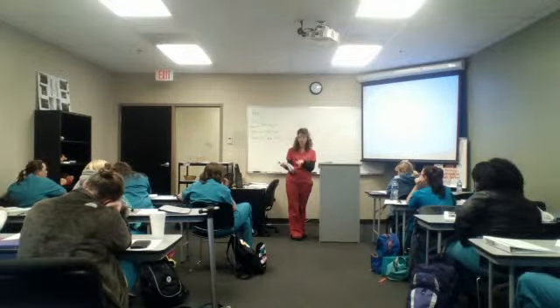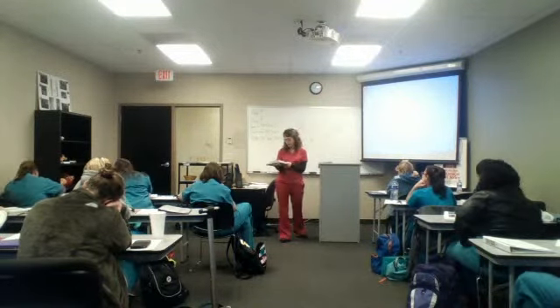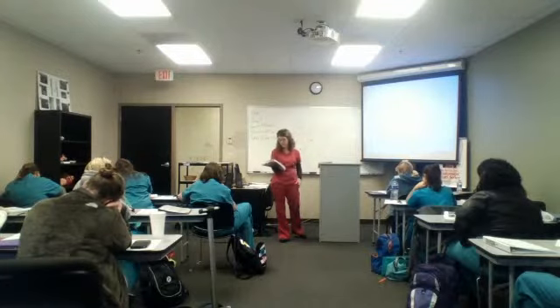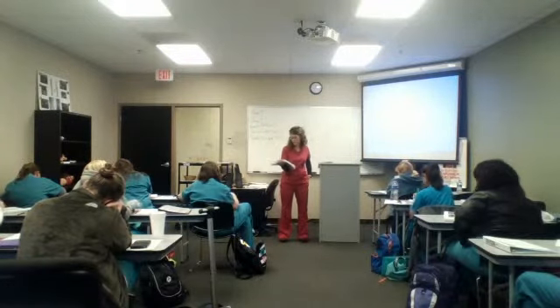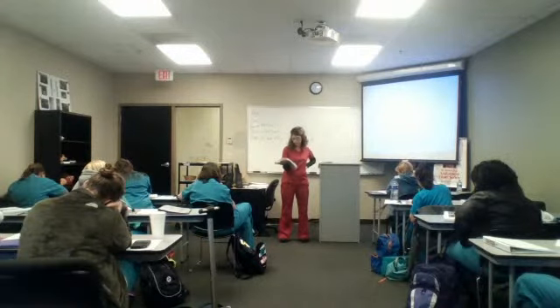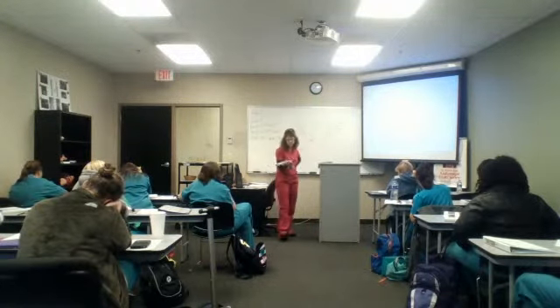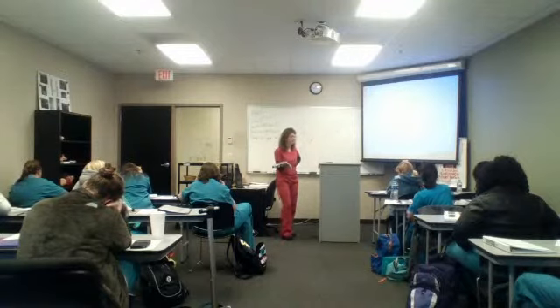But if a patient comes in hurting in their calf, it's very important for us to scan these veins because they're the most common site for thrombus to start. And so that's what it said. However, if a patient complains of pain or tenderness in the calf, you should look for thrombus in the soleals or the gastroc because they lie within the muscle. If they do have thrombus in them, they can be a very considerable source of pain for the patient.